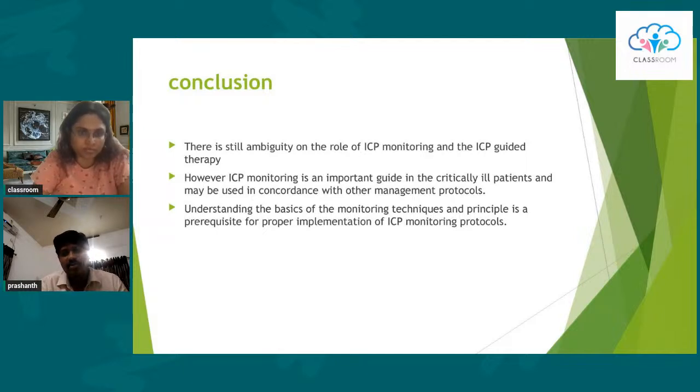But grossly speaking, ICP is actually a pressure difference. When you take the atmospheric pressure out of the equation, the ICP relative to the atmosphere is zero, because you've done the tier 3 therapy of decompressive craniectomy. Exactly. Yeah, but if you have an intraparenchymal probe, you can look at the parenchymal pressure, the compartmental pressure, and when you're using it with multimodality monitoring like PbtO2 and other cerebral blood flow monitors, it may definitely help in treatment decisions. Correct.